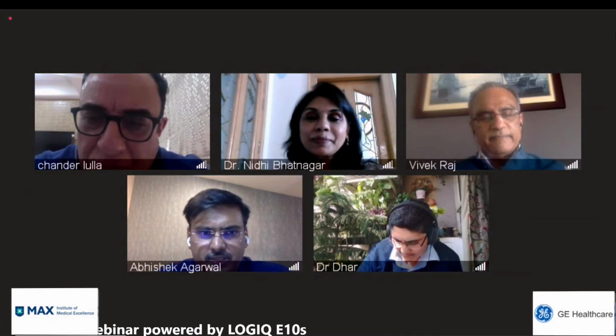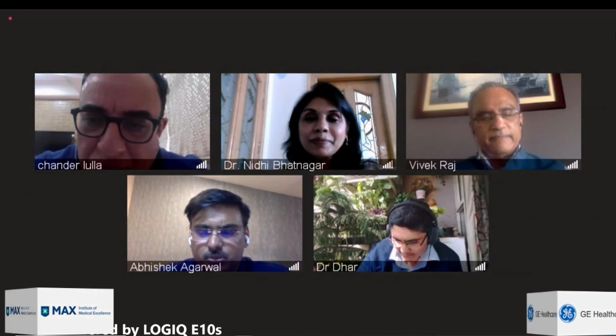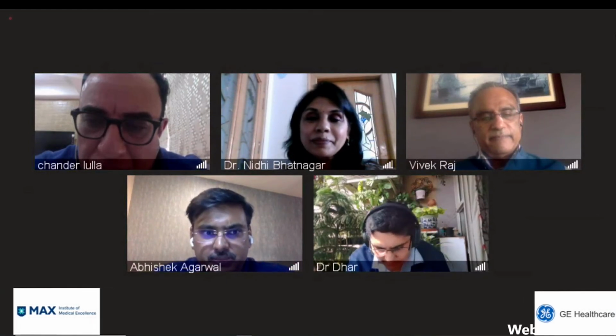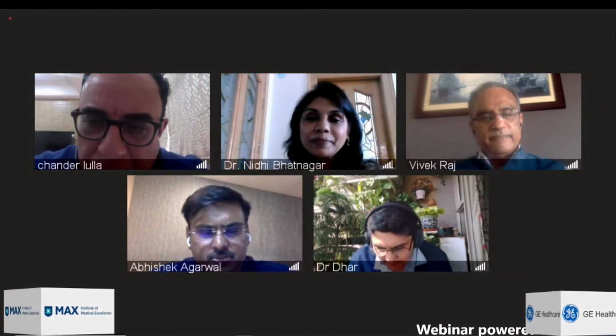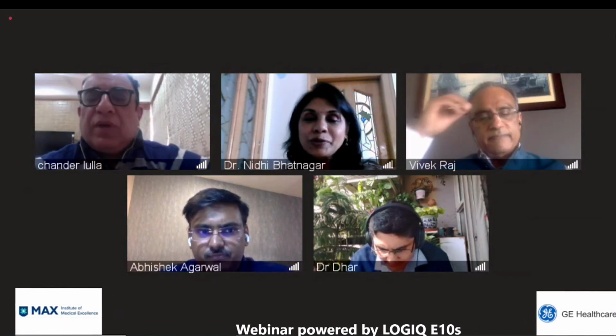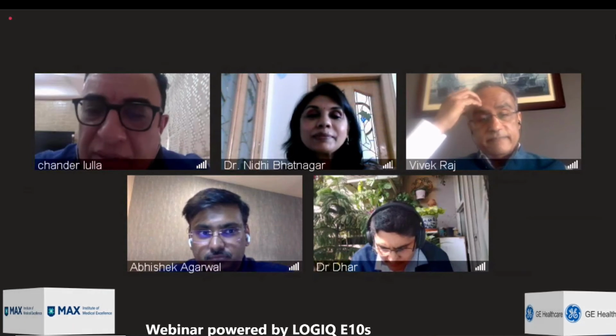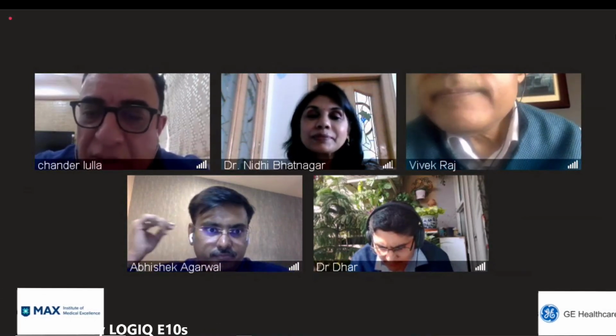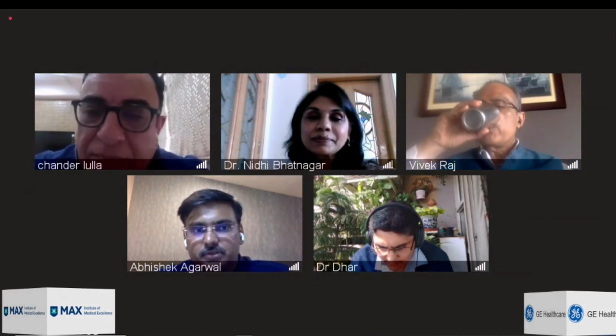I think the recommendation is that the size of the box may be bigger or smaller, but ideally you should not take all 10 measurements on a single box. Am I right? No. In fact, with 2D shear wave, you can take all the measurements in the same box. If the shear wave quality is good, you can take all the measurements. So that's what makes it easier.